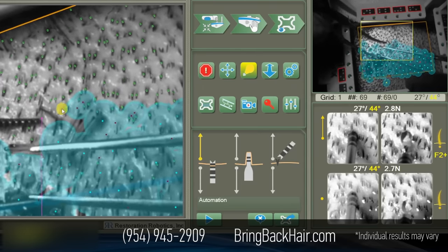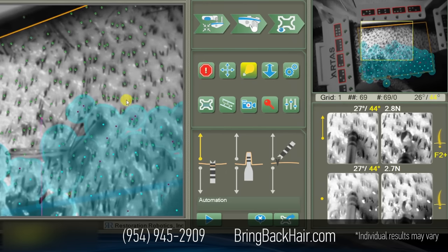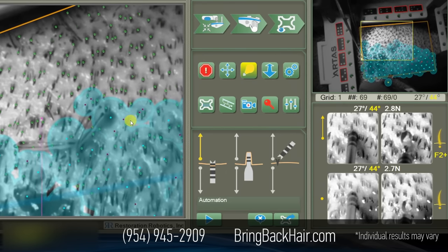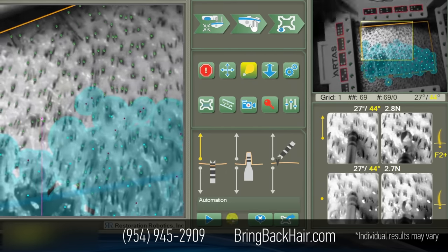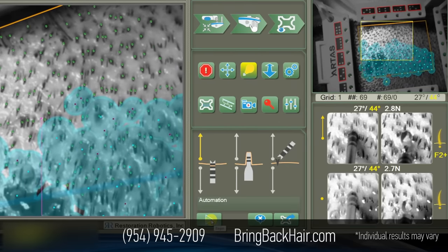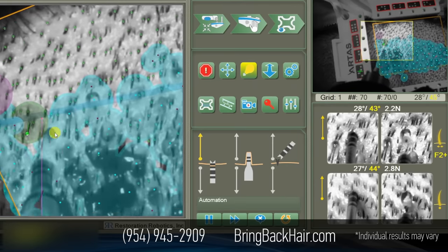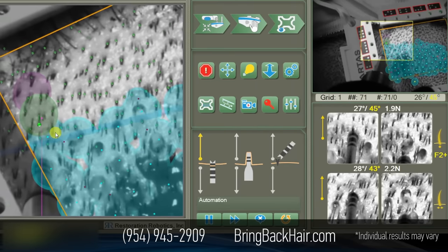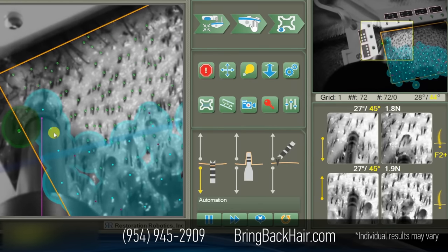We can see 88 follicular units per square centimeter — this is the average density. This is 1.1 millimeter, and that's the average hair length. And this is the angle: 35 degrees. I'm going to begin harvesting right now.